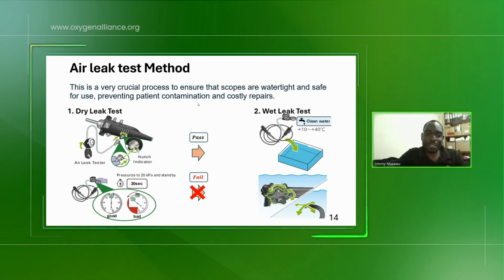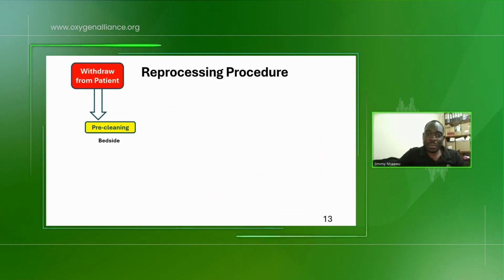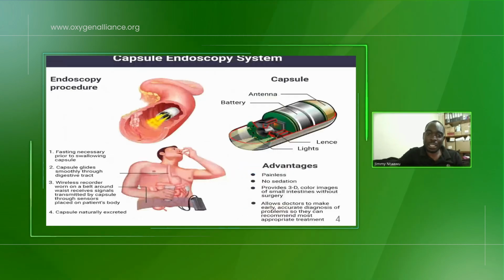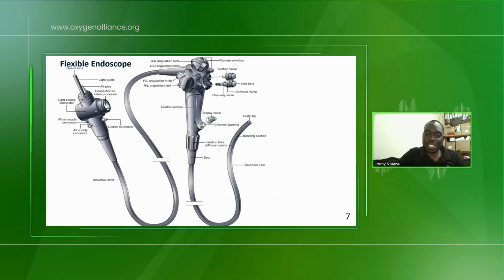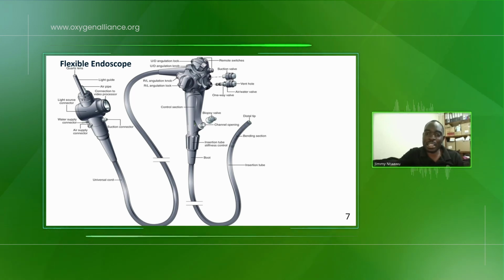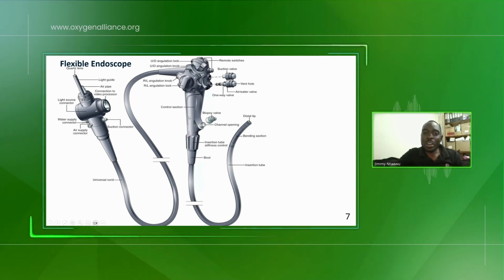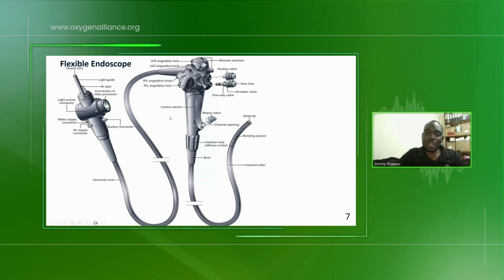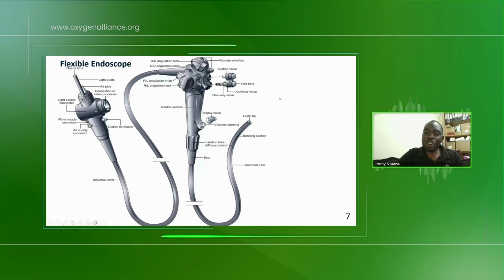Okay, angulation. Let me take you back to the knobs. What happens with angulation is a problem that arises because of the doctors. What doctors do, for example, when they are inside the patient, I can see an area of focus.